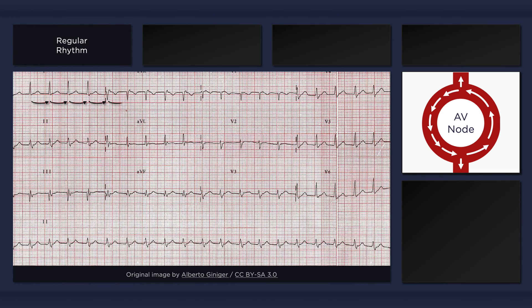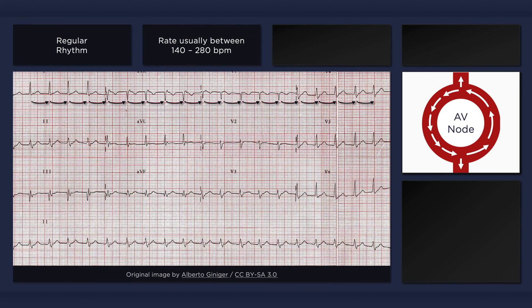Note that the RR intervals on this ECG are markedly consistent from beat to beat. The ventricular rate is rapid, usually between 140 and 280 beats per minute.